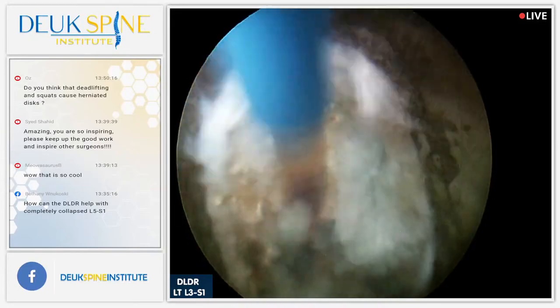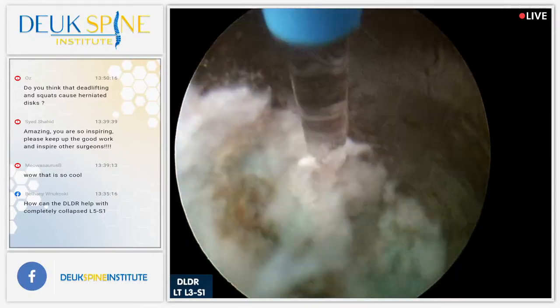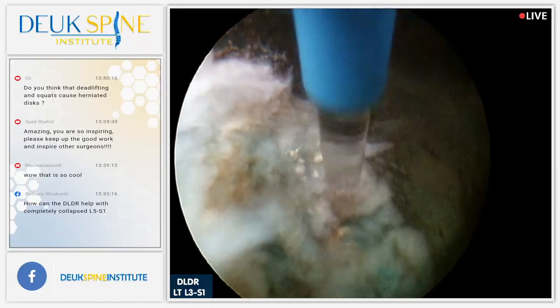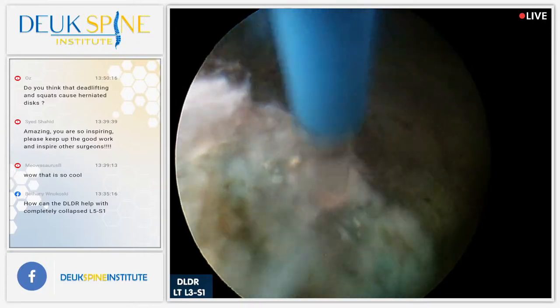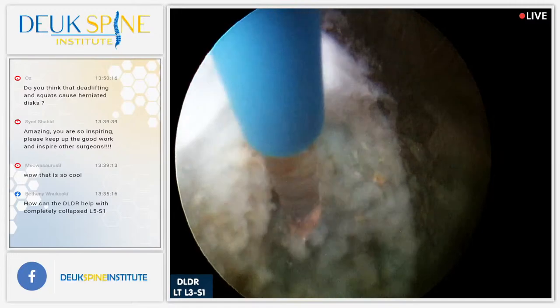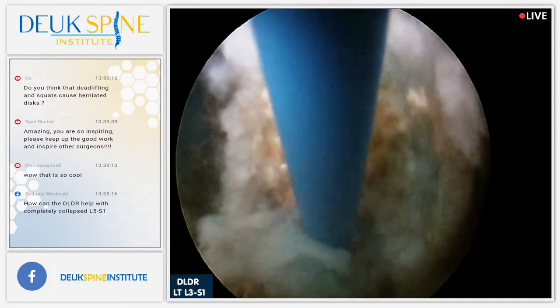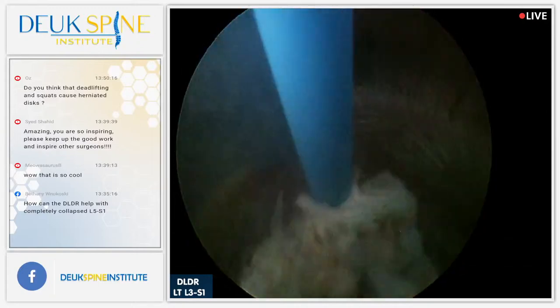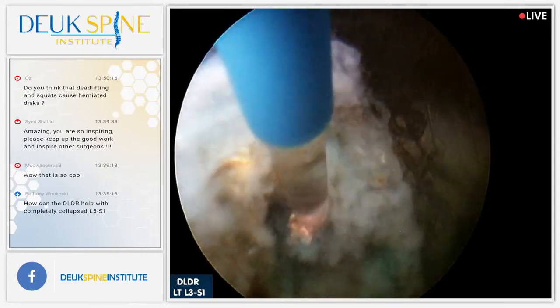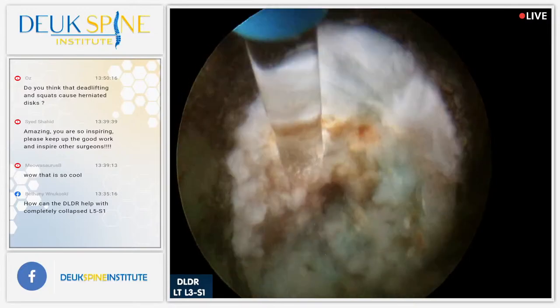This is the annular tear I'm debriding the whole time. I've been debriding it. That's where you find the herniated fragments of nucleus. People ask me, Doc, if you take all that out, then aren't you going to not have any disc left? No, we're not taking the disc out at all. We're just taking the herniation out. It just looks big because the magnification of the system is very high. We're magnifying everything a lot. I don't know how much we're magnifying it, but I'm not sure how to calculate it. I could tell you that fiber you're looking at is 1 millimeter.